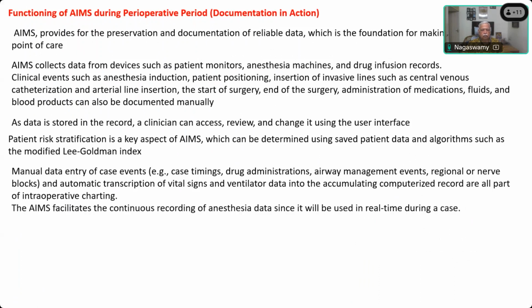Once you put it on a particular mode, it will automatically grab all the data from the monitor, ventilator, or the infusion pump, and it will record everything in the computer. It will be reproduced whenever you want to see it again by the click of a button. So AIMS facilitates the continuous recording of anesthesia in real time during cases. Every second, every minute, depending on the setting, it will be recording all the time, so that you can pick it up at any point of time you want to see what happened.